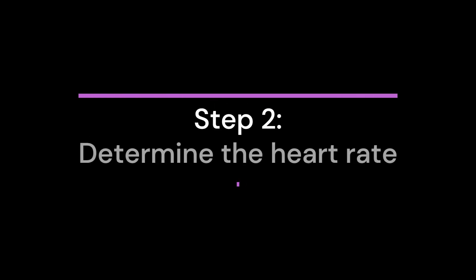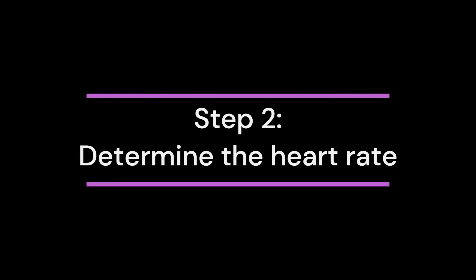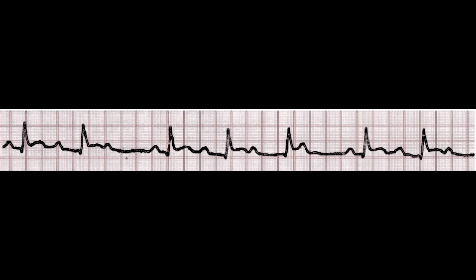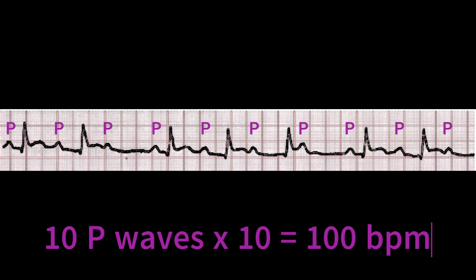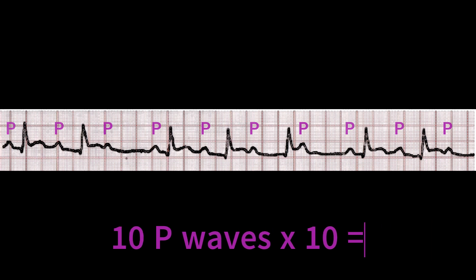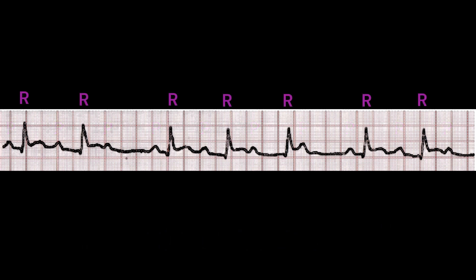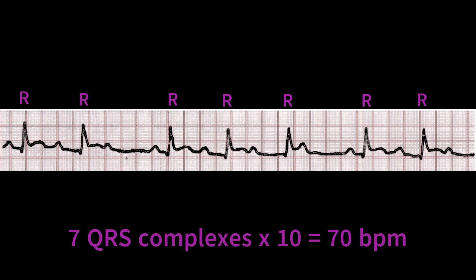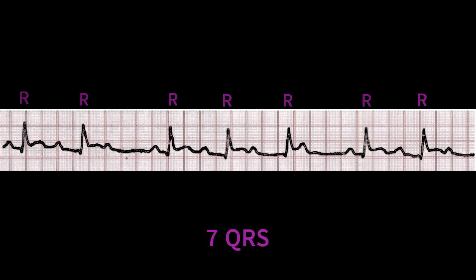Step 2: Determine the heart rate. The atrial rate is always greater than the ventricular rate in Mobitz type 1. In this 6-second EKG strip, we can count 10 P waves — multiply that by 10 and we get 100 beats per minute as the atrial rate. There are 7 QRS complexes; multiply that by 10, giving us a ventricular rate of 70 beats per minute. Both rates are usually within normal limits, meaning 60 to 100 beats per minute.